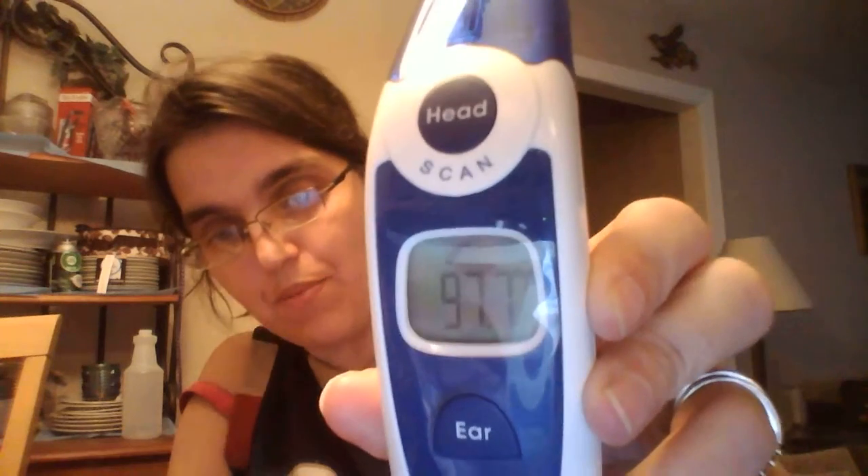It comes with a nice little bag. Here's the thermometer as you can tell. This is for the forehead. I'm going to go ahead and turn it on. You see it's on and I'm just going to press the head button and go over it — it shows that my temperature that way is 97.7.